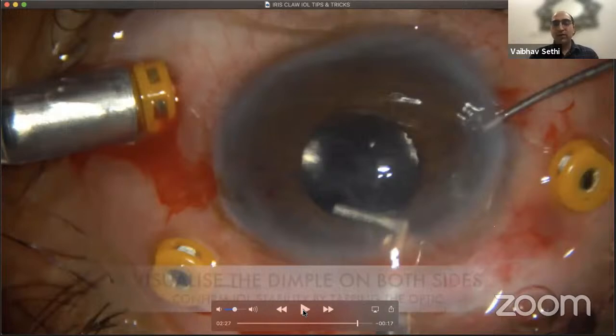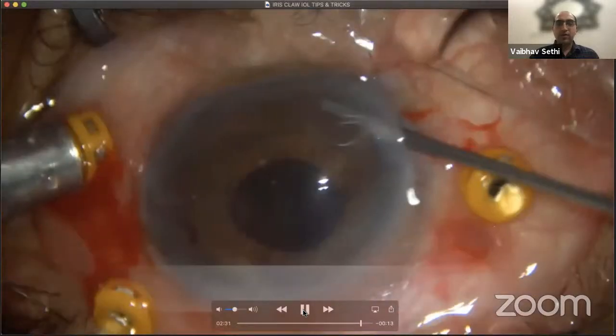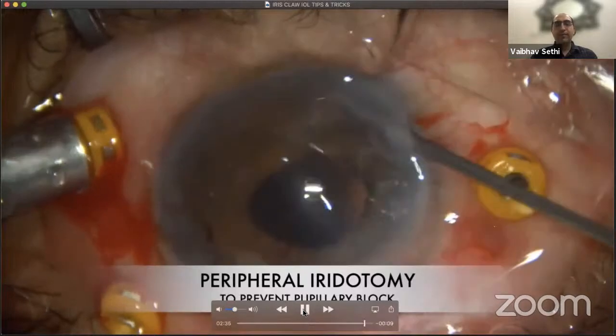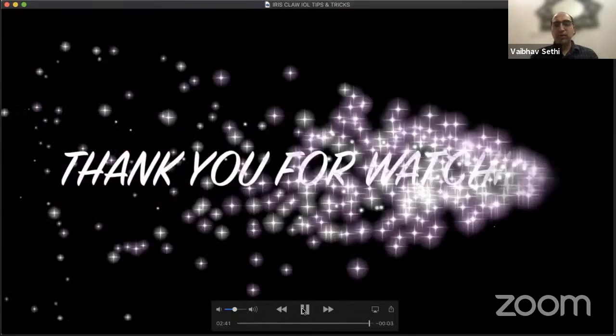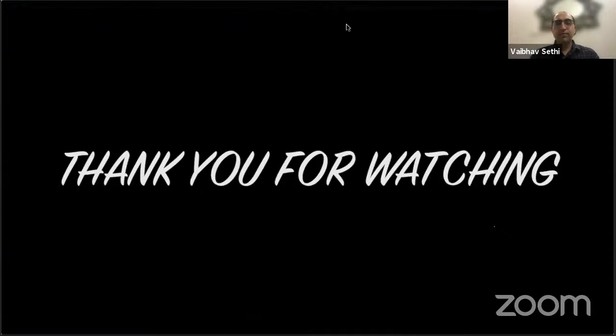Another way to be sure is to just tap on the optic. You see it's centered, it's there, it's not fallen down. So there's no clearing. Also, what I do most of the time is create a PI, just to make sure that there's no pupillary block, and finally suture the ports or just close them the way you want if they're not leaking.